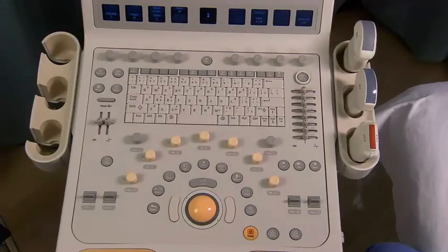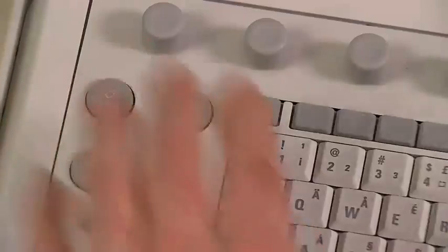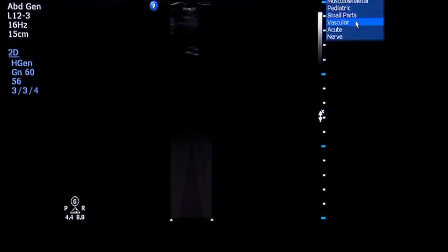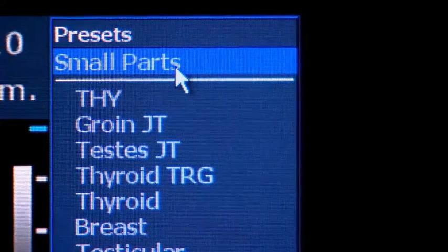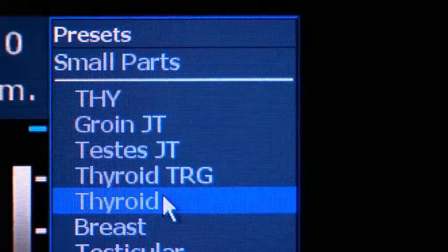Select the appropriate transducer for the thyroid examination. Select the standard preset for thyroid and parathyroid sonography — this may be listed as small parts on some machines. Select the appropriate setting for a thyroid scan.